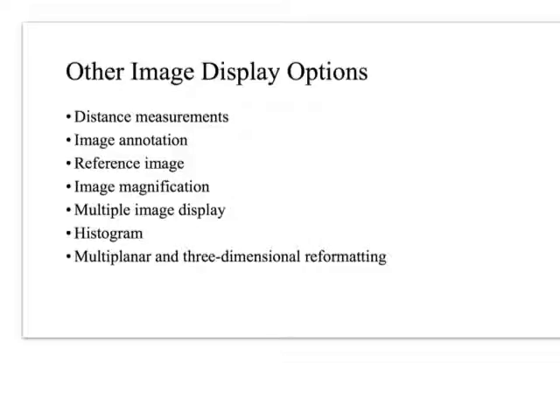The histogram, from a CT tech point of view, can be used to sample things in real time, so it will be tied to certain protocols. And we'll come back to that in the summer. I'm not necessarily going to test you on that right now. Okay? And then, of course, we've got multiplanar and three-dimensional reformatting, which we'll get to at a later time.